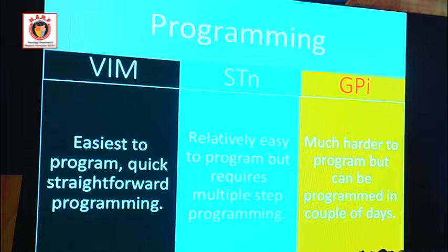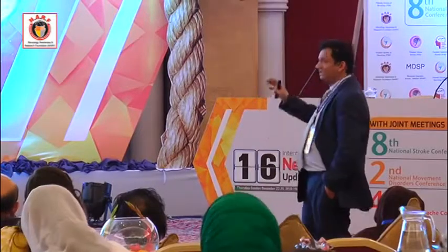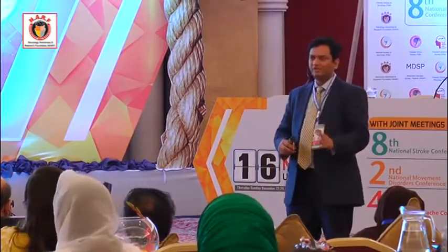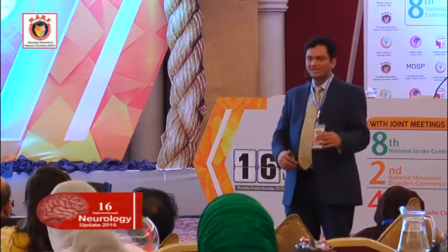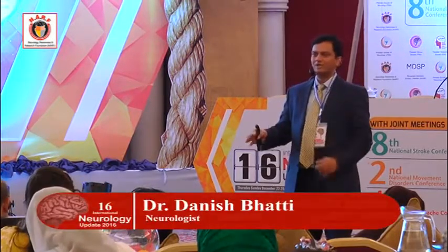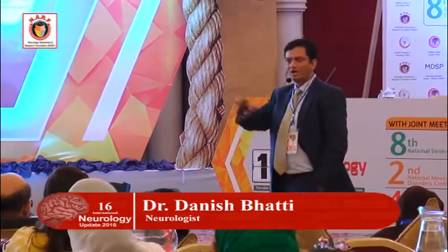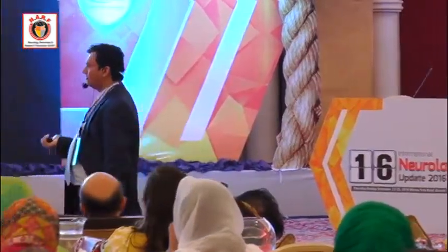You can't just do programming in one day with STN. You have to do it multiple times over weeks and months. GPi, you can do the programming in 2 days straight. You do 8 hours one day, 8 hours the next day, and in 14 to 16 hours, you're done with your programming. However, it's a very complicated programming with a lot of algorithms on what to do next, and switching back and forth. So it's harder programming, but you can just do it in 2 days and forget about it. STN, you have to do it multiple times.